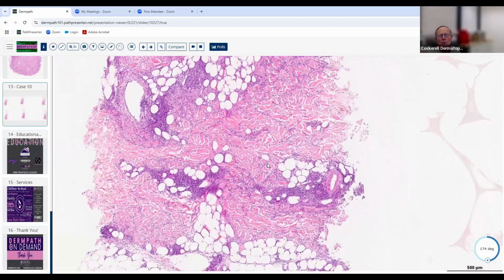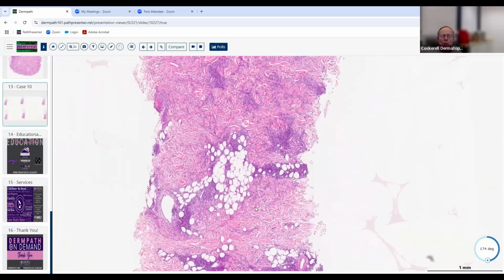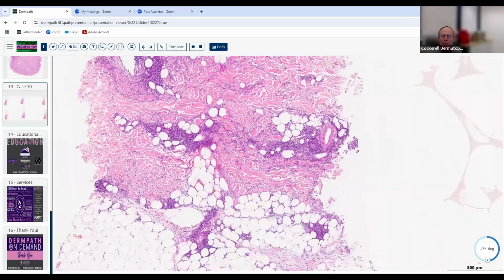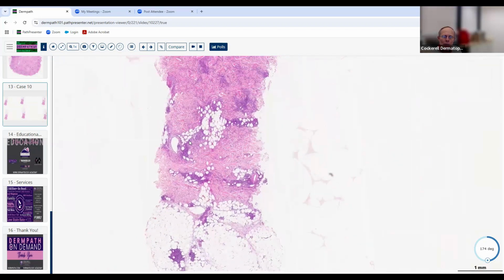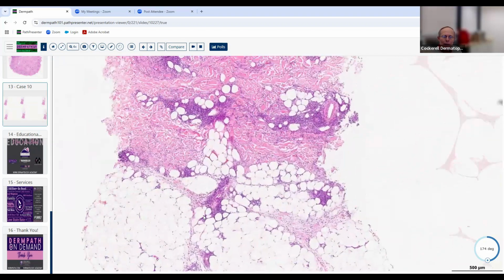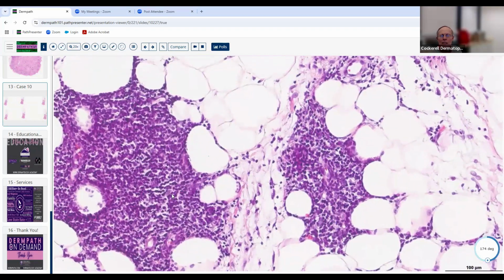You're probably not going to get anything like this on the board examination either, because this was actually a challenging diagnosis that we had. But basically, in this case, this was an individual that had an insect bite reaction at this site. The thing persisted, and then they started getting symptoms that were analogous to Lyme disease. So you can see this maybe starting to appear like a bit of a lymphocytic infiltrate here. Goes down into the fat, okay? But it's also interstitial, so it's not one of the classic lymphocytic infiltrates. And this also has some plasma cells in it.